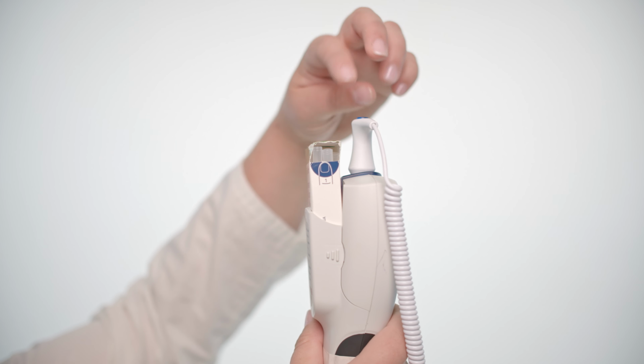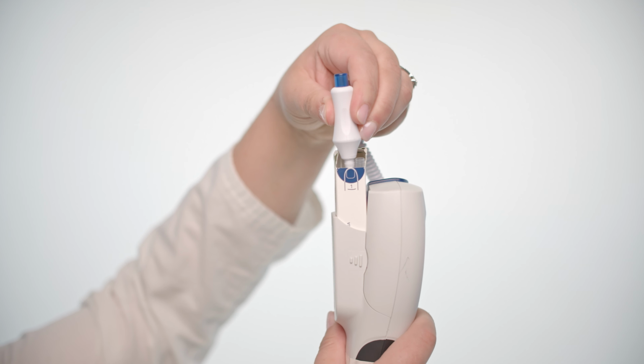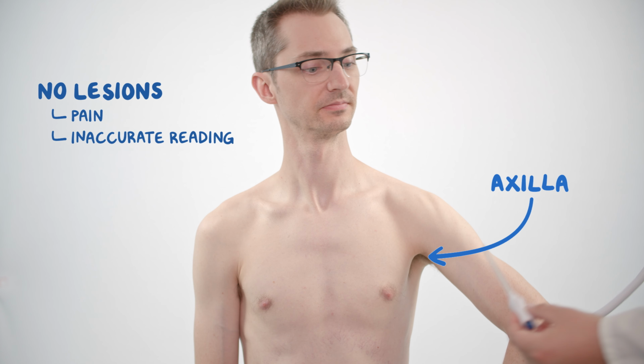We can also take Fred's axillary temperature. Attach the blue oral probe stem to the thermometer. Slide over a disposable probe stem cover. Lift up Fred's arm to reveal the axilla. There should be no lesions present. They may cause pain or an inaccurate reading.